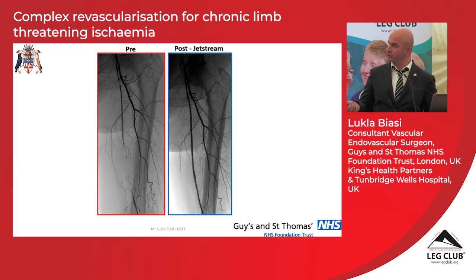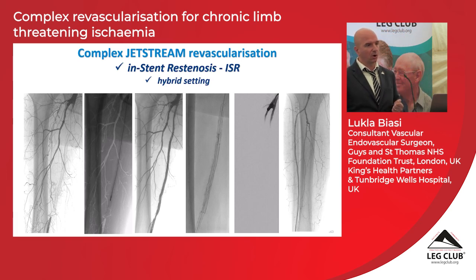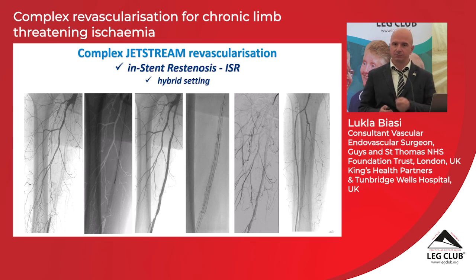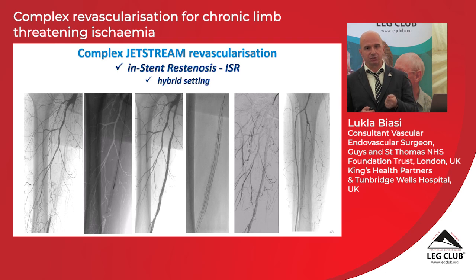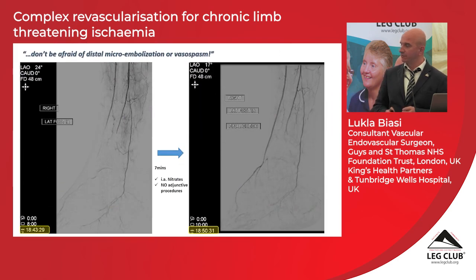So that was the artery before, a very extensive blockage in the femoral artery at the thigh level, and that's the result after. What we call a restoration to the complete integrity of the artery. Another example: you can see now the running image of the catheter drilling through. In this case, the patient had a previous stent that was completely blocked. As I said, until now, the only option to retrieve a blocked stent was to undergo bypass surgery. Now with these atherectomy devices, with this drilling technique, we can try to salvage occluded stents. And here's the result after the procedure of the flow through the artery.